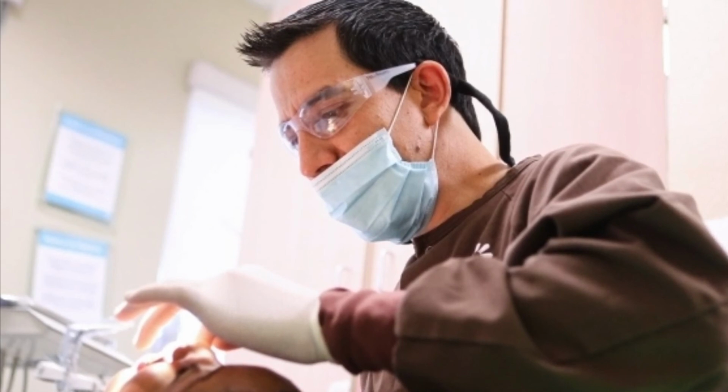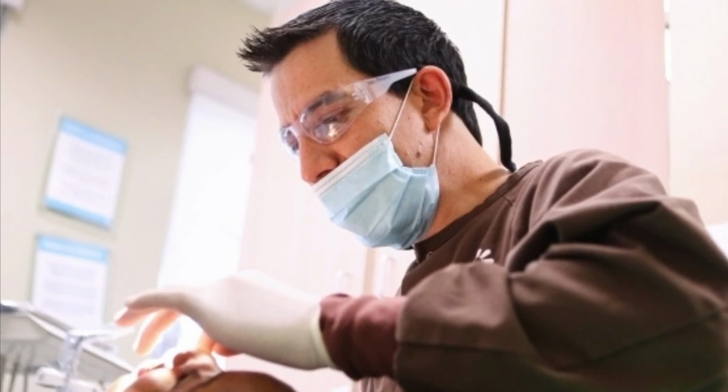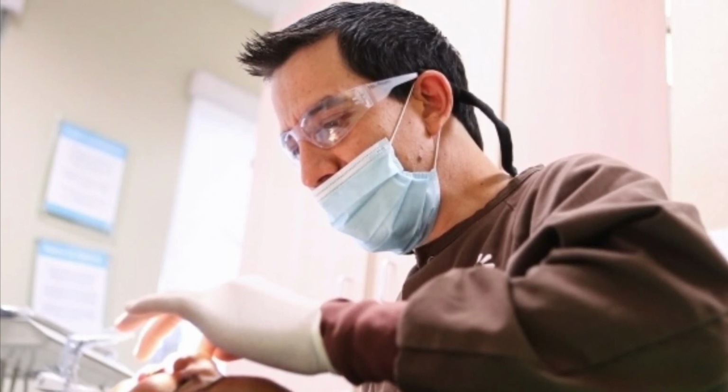It's not a cross-section of the triangle or square. This one is called K-flex. You have to differentiate between K-flex and K-file.